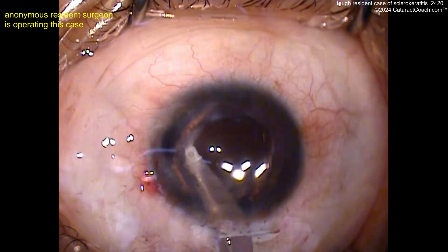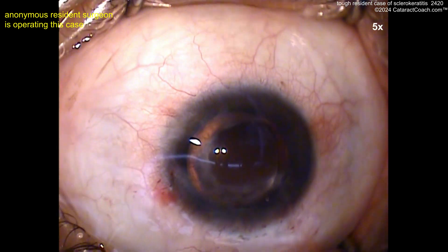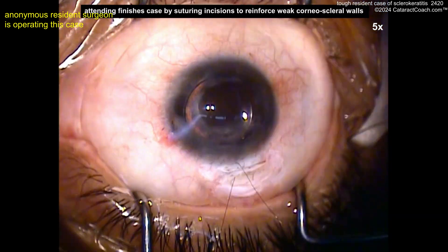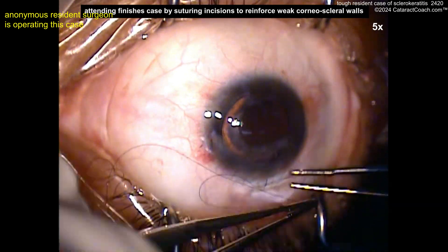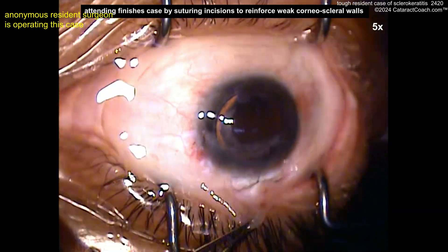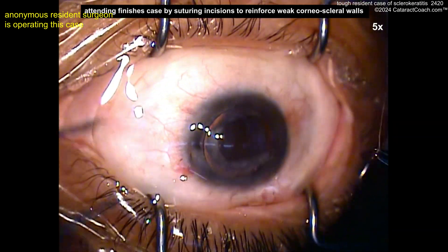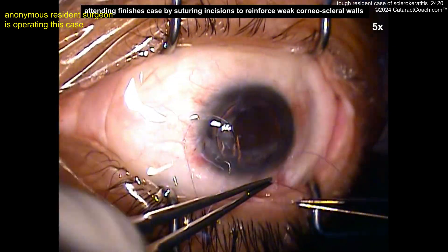Now let's look at the back end of this case — removing the viscoelastic. Nice looking case here. Obviously you put in a monofocal lens here; do not put in some sort of fancy lens in this case. And now at the end, suturing up the scleral tunnel. For a resident case, I like it — this kind of tunnel should seal up on its own, but a resident learning how to do good sutures is always a good technique. And now here comes a microsuture, probably to close the conjunctiva.